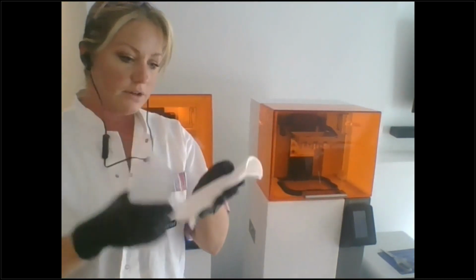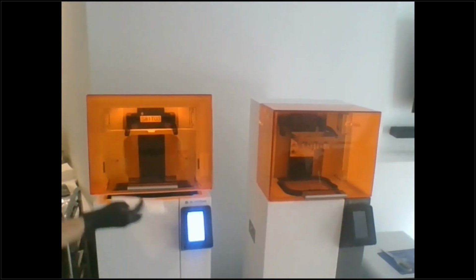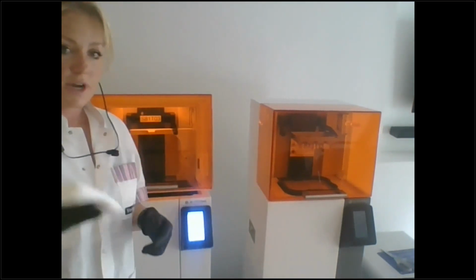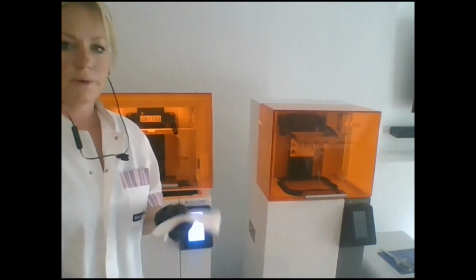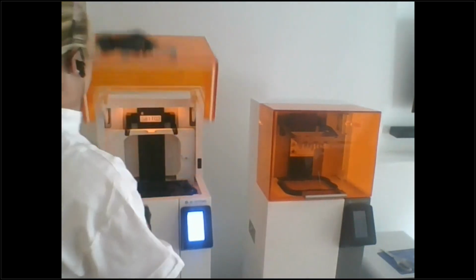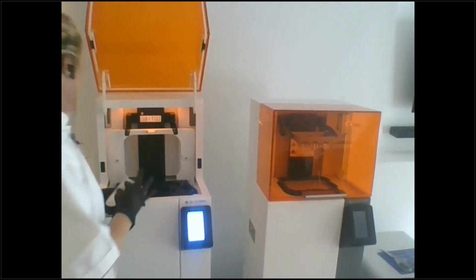So I use this little bottle and I always keep this cloth in this bottle nearby and I just put some alcohol on it. You don't want to clean your orange lid with it because that will dry it out, but you can use it to clean all the other parts. So the orange lid can just be cleaned with soap and water or a soft cloth. So the membrane lip is what can cause stress on your membrane. So what you want to do is make sure it's always clean.